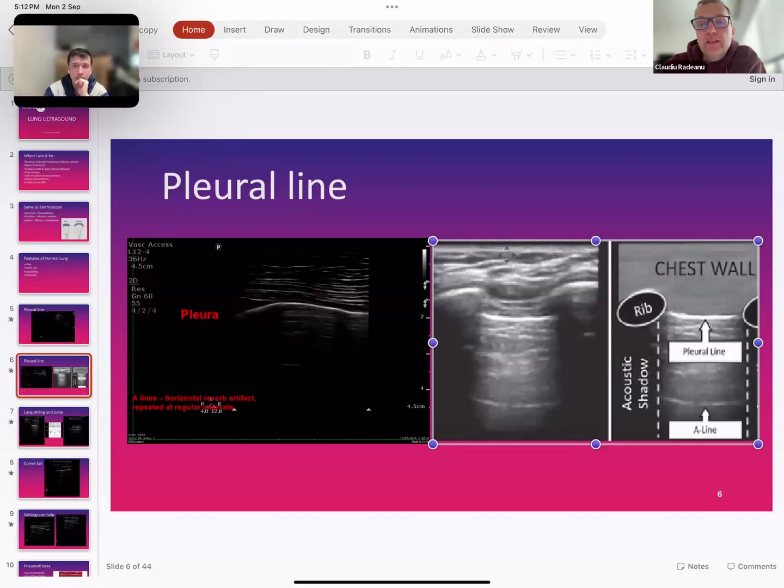And then when it hits the ultrasound probe, bear in mind it is air in this area as well. It bounces back through the skin, travels back towards the pleura, and therefore hits air as well, and bounces back towards the skin. Does it make sense what I'm saying? And therefore you have what you see, the images of A line.